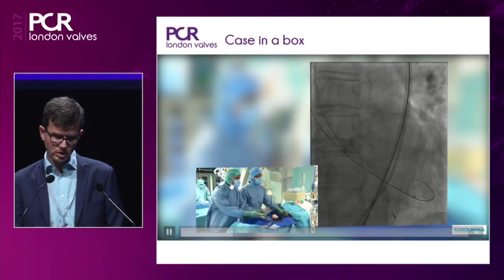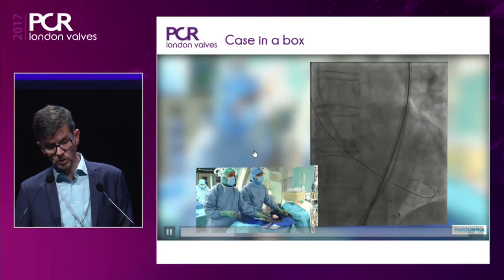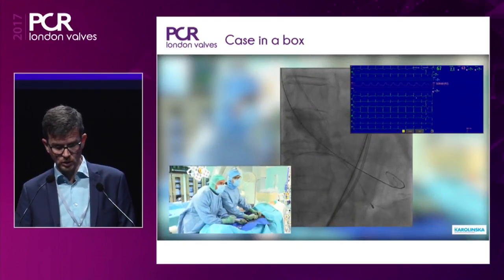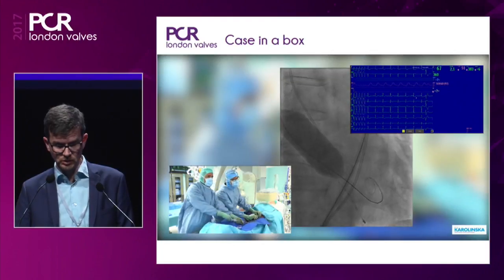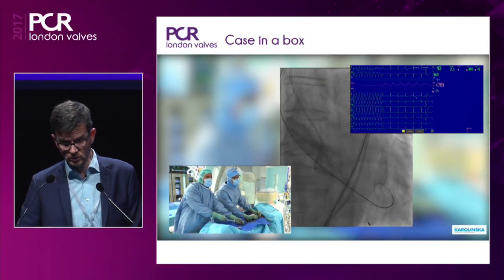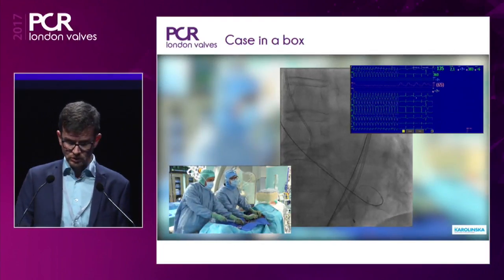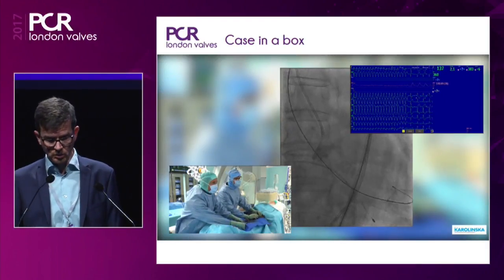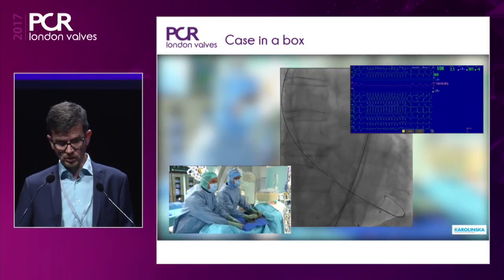This is the pre-dilatation. It's a requirement for most patients. It doesn't need to be with an oversized balloon — in this case it's a 24 balloon in a 25 annulus. It's a True balloon with brief pacing, and the recovery of blood pressure is almost instantaneous.